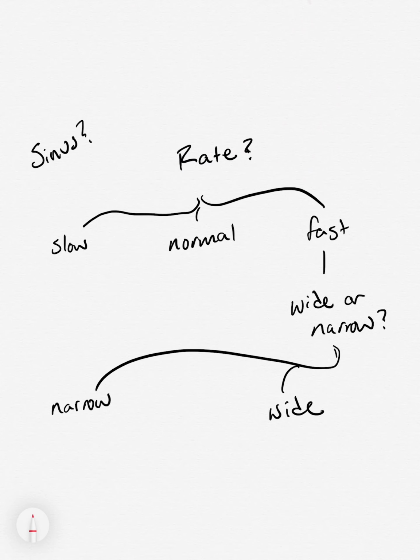So over the course of this class, we've learned how to analyze EKGs by approaching them in a stepwise fashion, a systematic review, if you will. And the first question that we've always asked ourselves in this process is, is the rhythm that we are seeing a sinus rhythm? And for this video, because we're talking about wide complex tachycardias, the default answer to that has to be no. These are not going to be sinus rhythms.